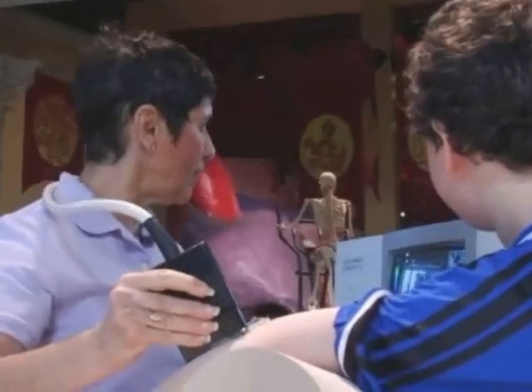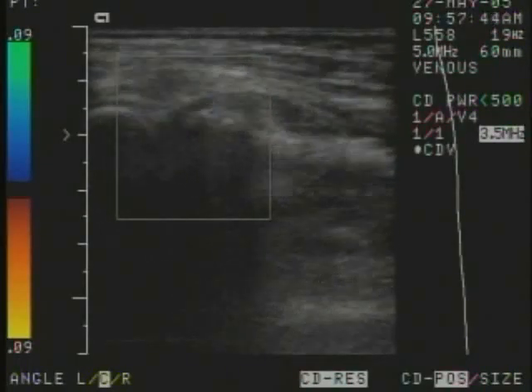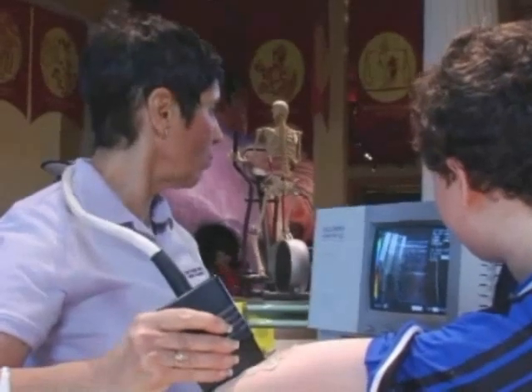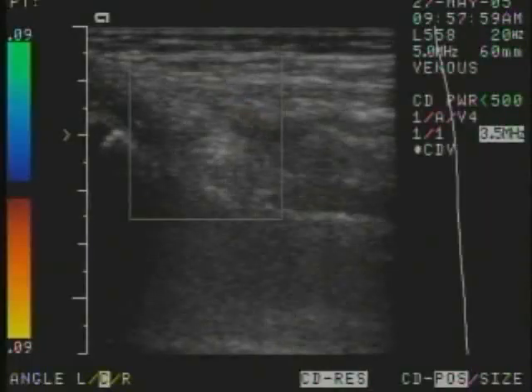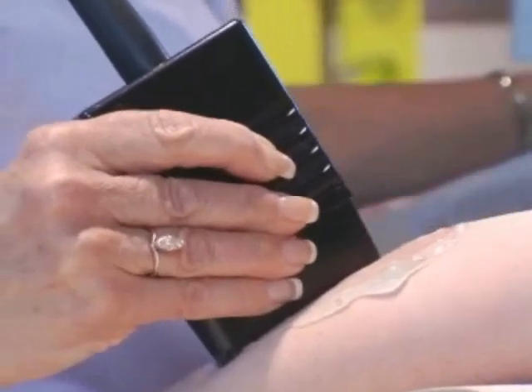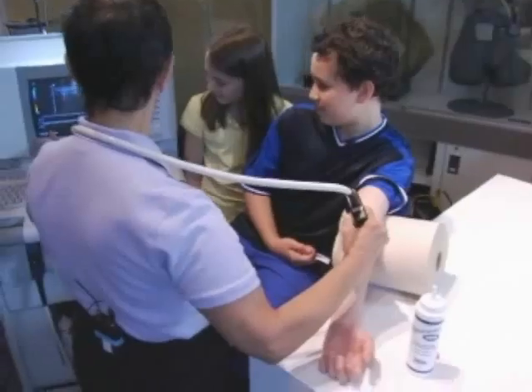Here's our screen here, and there's his elbow. See the joint? There's a bone going into it. Now let's see if we can find an artery. Whoa. See that flashing right there? Would you like to see if we could hear it? And that is your blood going through your artery.